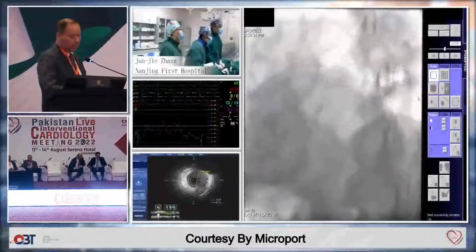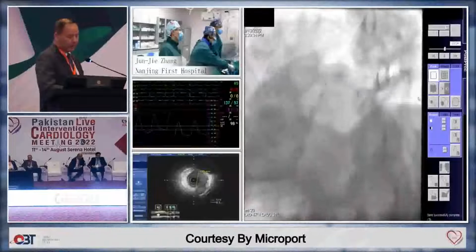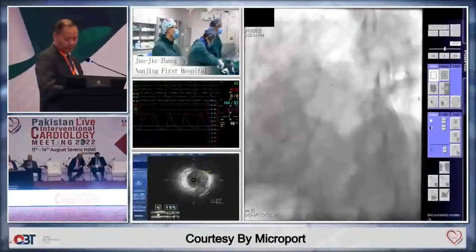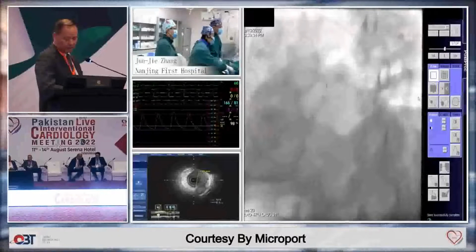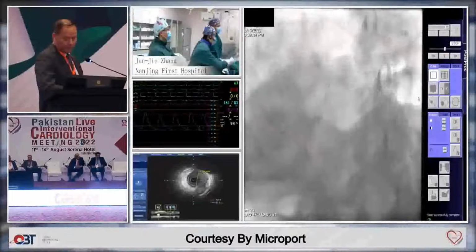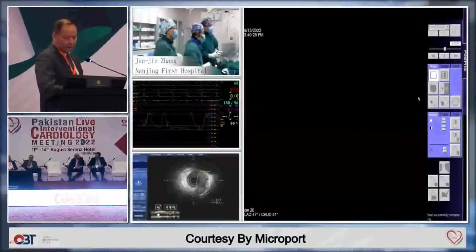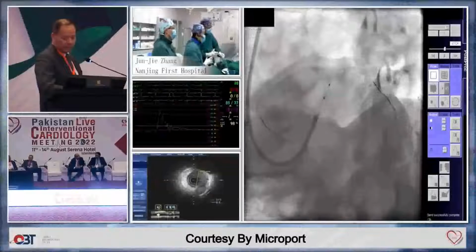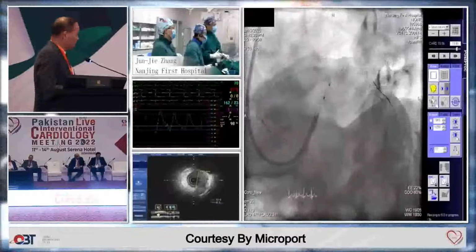According to the image, you cannot see clearly how long the protrusion of the side branch stent into the left main is. From our side, maybe 3 to 4 millimeter is protruding into the left main. This is the main vessel balloon going to do the first balloon crush, looks like the crush of the side branch stent.